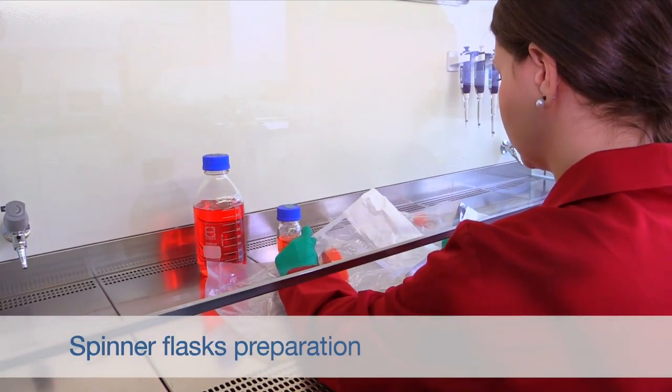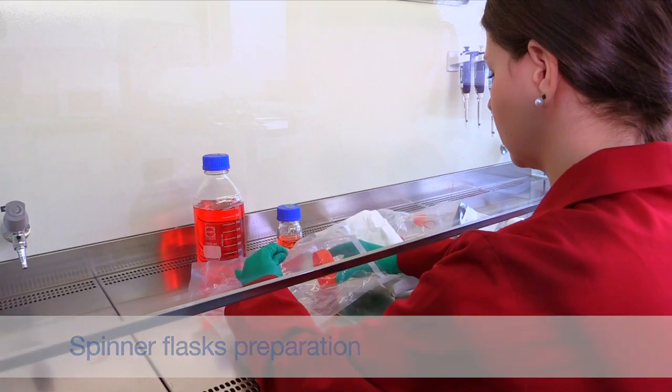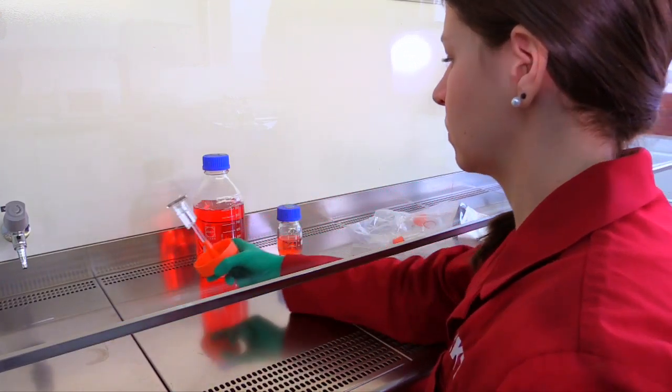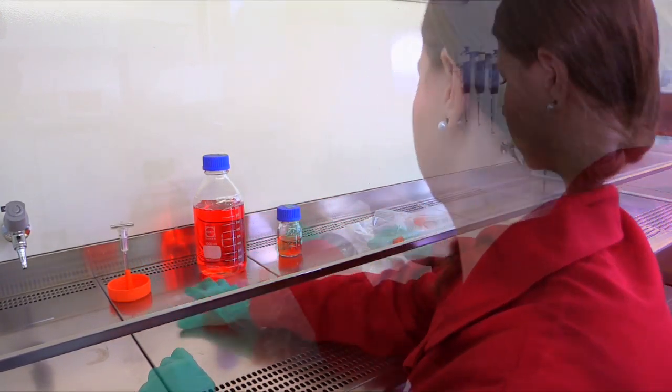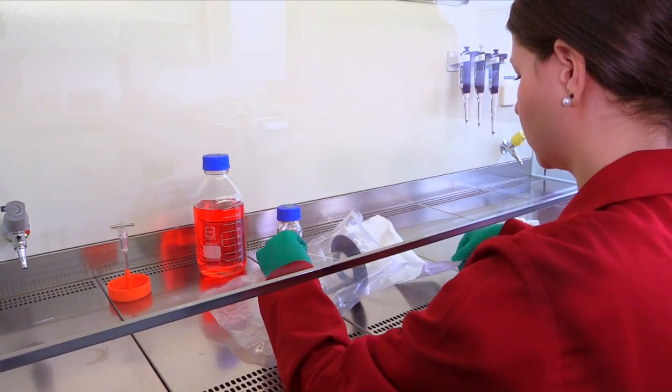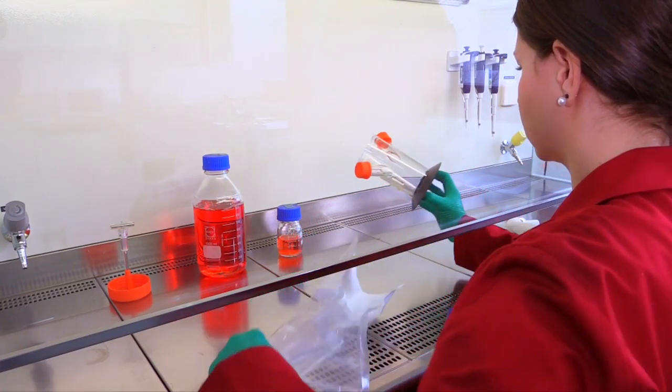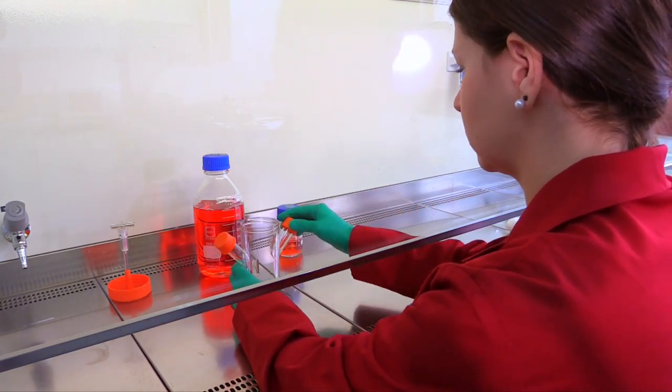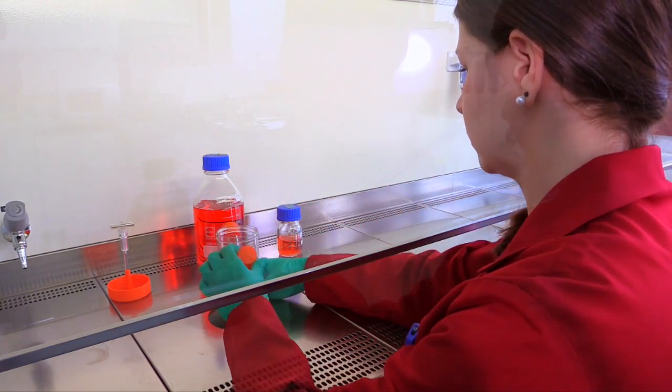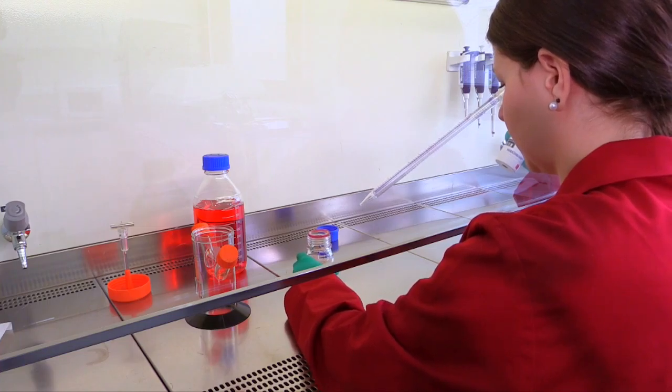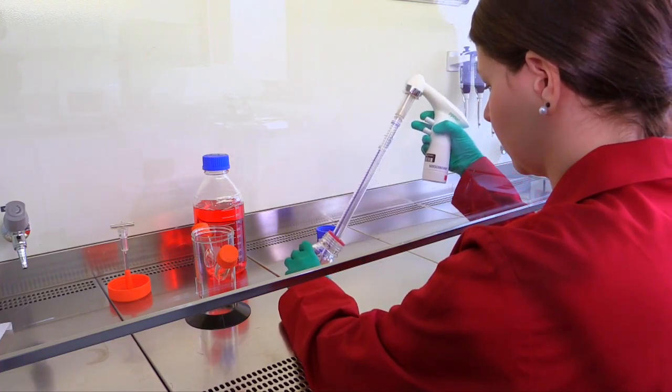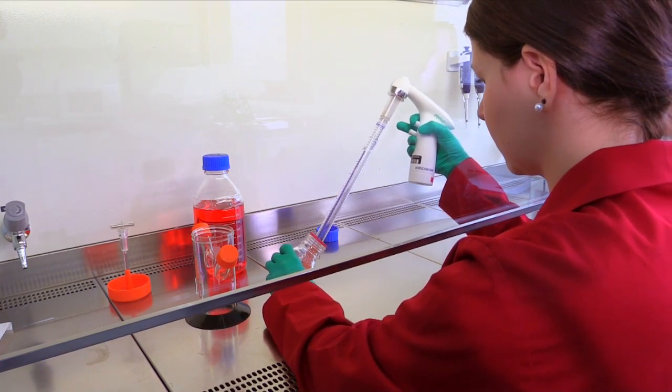Afterwards, the spinner flasks can be unpacked in the laminar flow bench and filled with microcarriers and medium. The working volume of every spinner flask is 100 milliliters.